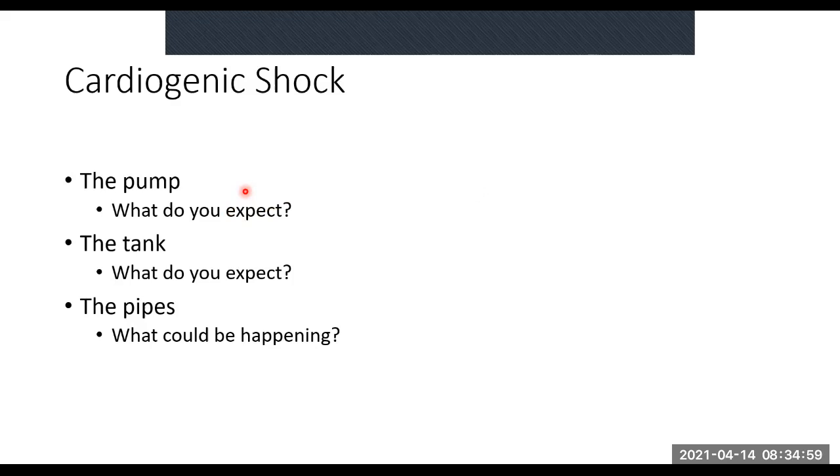So we're going to see this heart that's pumping very slowly, that's struggling, that has a poor ejection fraction, which I'm hoping to show you next week, how you work it out. It's actually very simple. We all look at echo reports and go, wow, ejection fraction. It takes literally 1 minute to work out. We may see direct damage to the heart. If there's an ischemic part of the heart, it may not be contracting, or it may be contracting incorrectly.